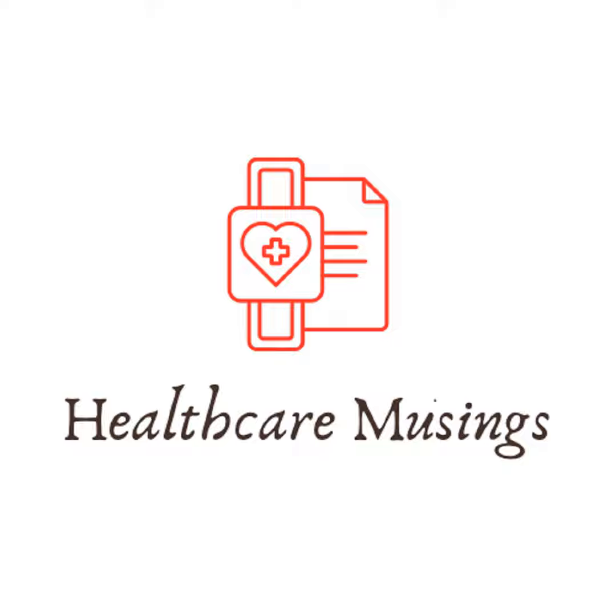This is why I don't like SIMV, for no other reason than that it makes the patient breathe. It increases work of breathing. I mean, think about it. You have big breaths, nice big breath, and then another. Especially someone who just came out of surgery, right? They're just waking up from anesthesia. They're not going to have a lot of effort. So if this pressure support number is too low, they're going to struggle to breathe. Why do that to the patient? That's why we don't do synchronized intermittent mandatory ventilation. It's an old relic of the past that should die like the dinosaurs did.